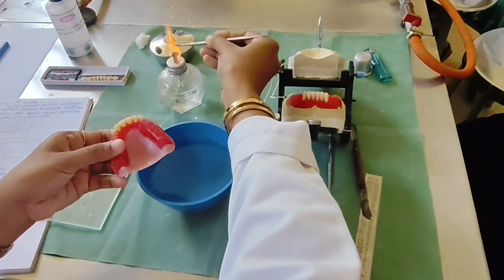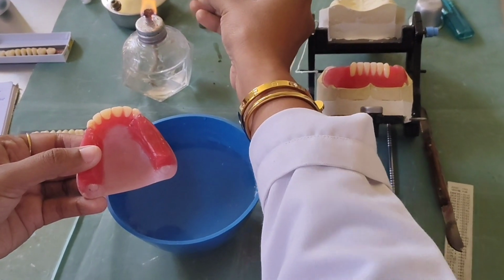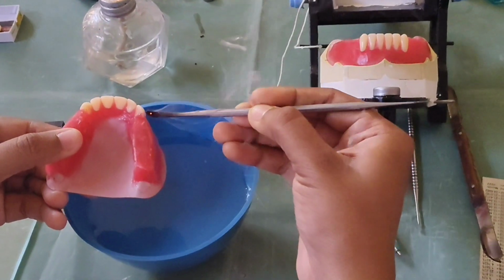You don't have to put this over the cast and do it. Never. When you are melting, it should be in your hand. It shouldn't be on the cast while you are melting.